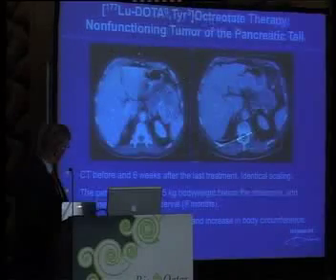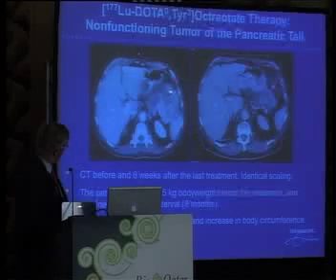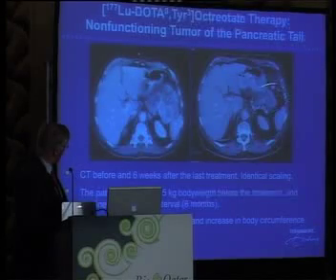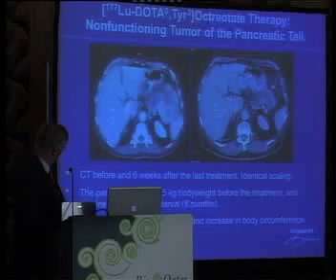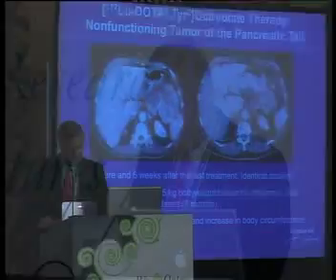And then the 2 last cases are important. You can see that also already on the scan, on the size of the scan. Here you see 1 tumor and here the effect. And that is indicated here that the patient lost 15 kilograms body weight, and after the first treatment, in 8 months, the patient regained 14 kilograms, indicating that the patient is doing much, much better.